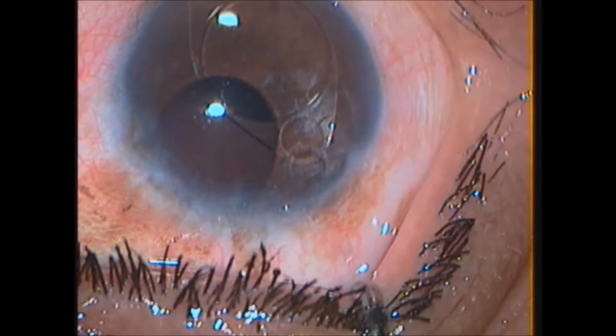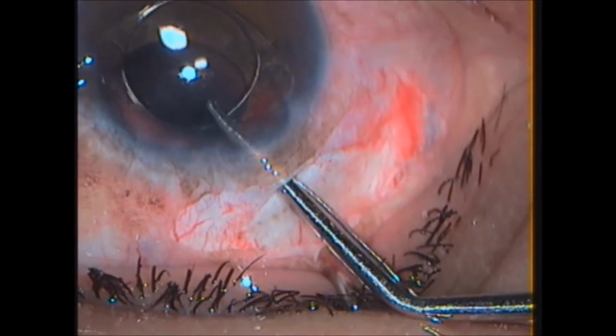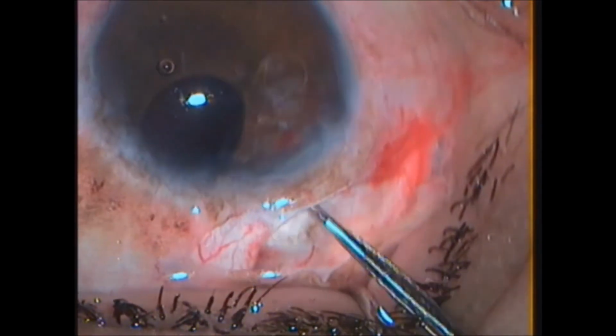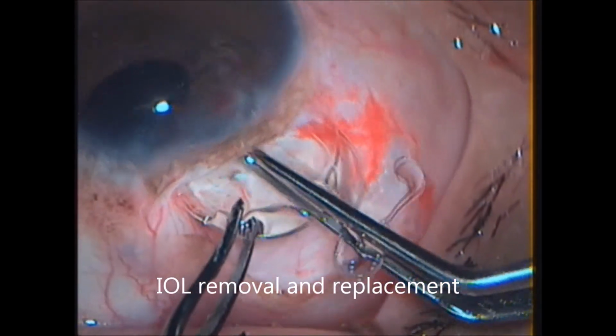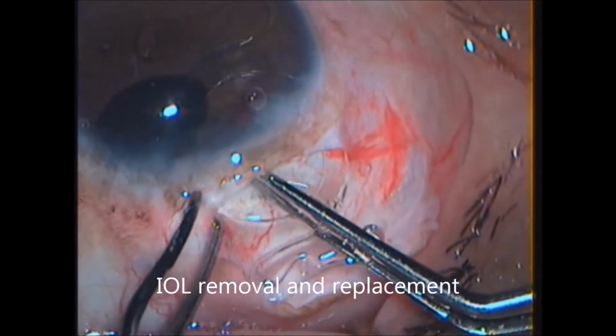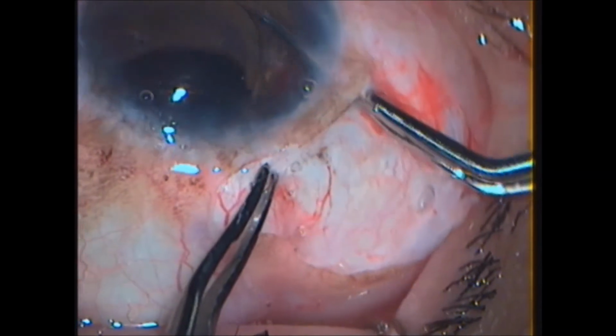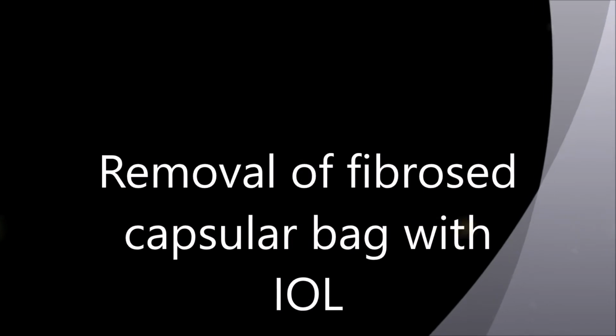There was another situation where an iris claw IOL was hanging. One haptic was placed and another was loose. So the attached haptic was removed. As there was no support of the posterior capsule, the pupil was updrawn. It was replaced with an anterior chamber IOL.